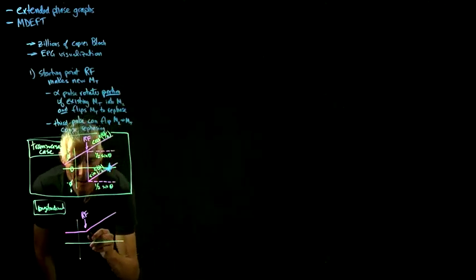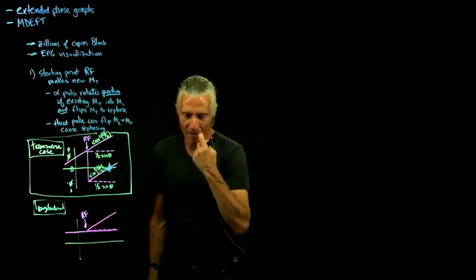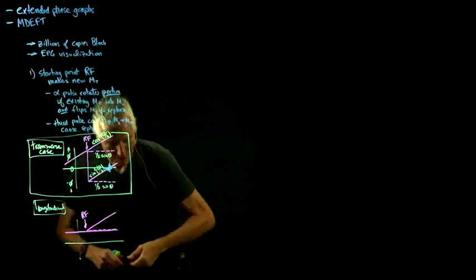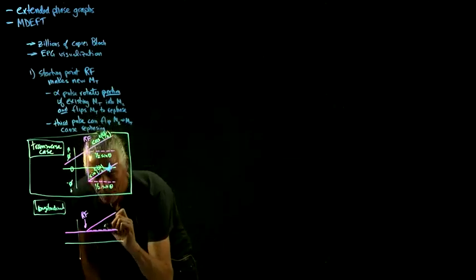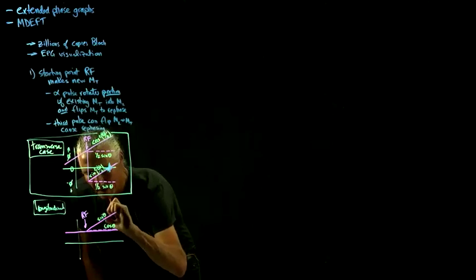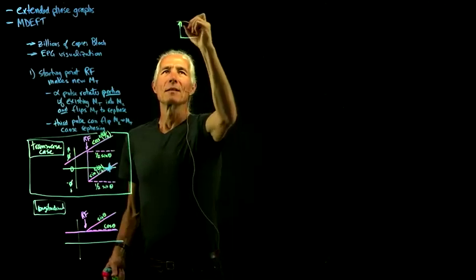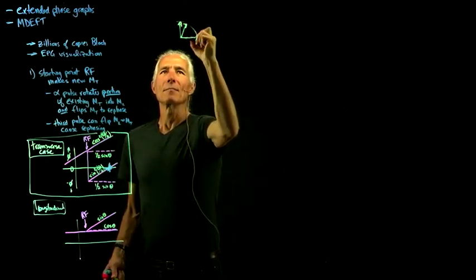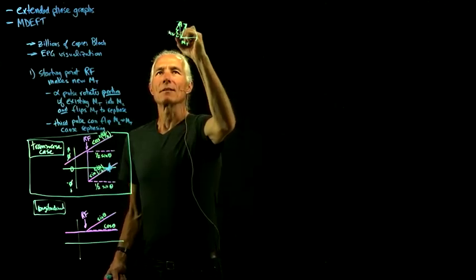And then we will leave some of it. There's actually 2 pathways on top of each other here that are 180 degrees out of phase, but we'll just leave that. And so the amount, this is just those 2 together is just the cosine of the angle. This is just the sine of the angle, like we normally do when we're just drawing our diagrams like this, and we sort of calculate how much transverse we get, how much longitudinal is left.